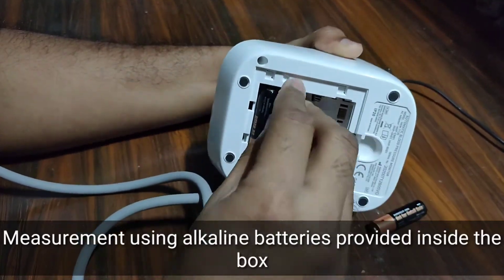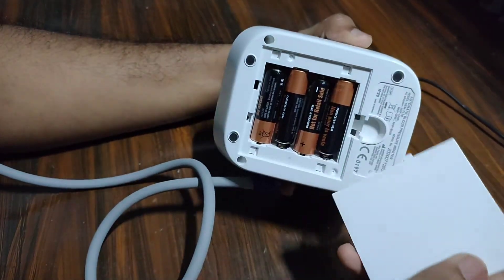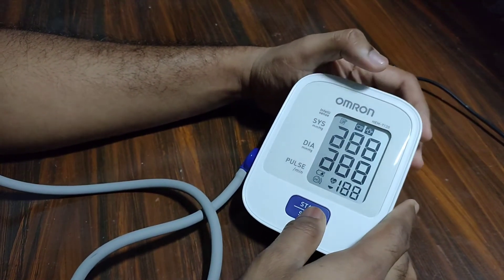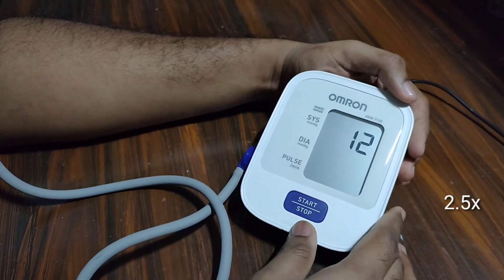Just after that I took readings again using alkaline batteries. Omron claims a battery life of 1000 measurements for every new set of batteries.